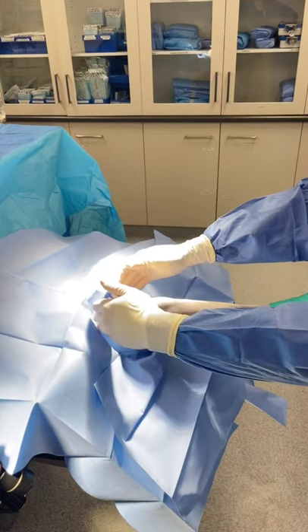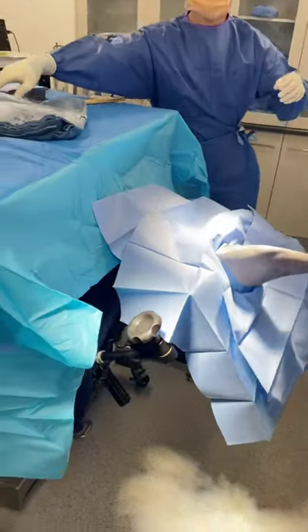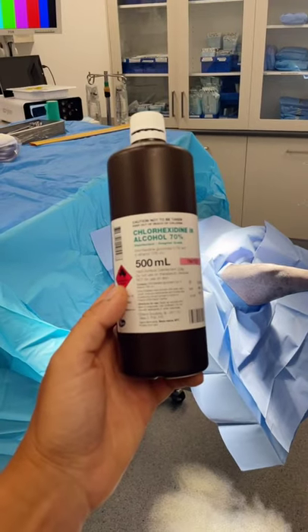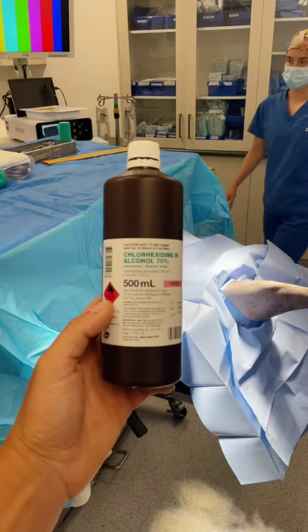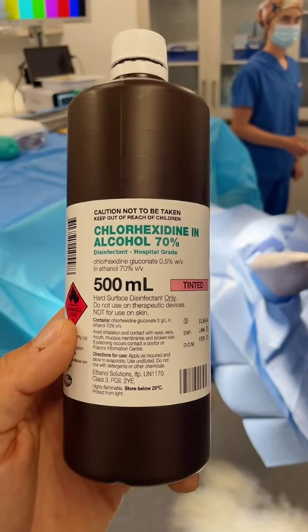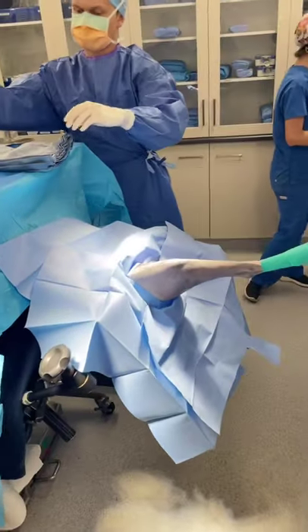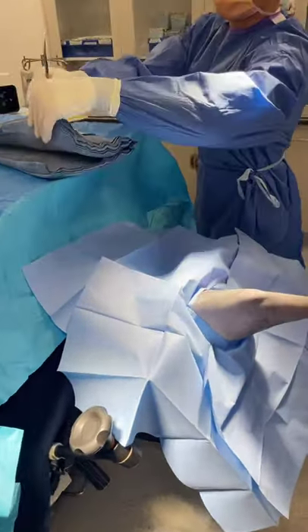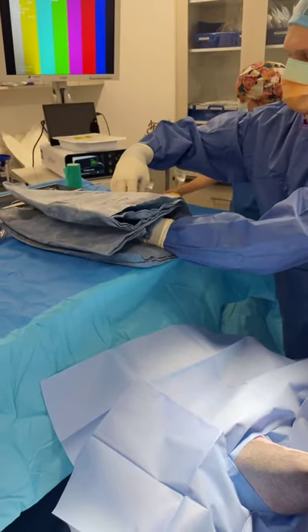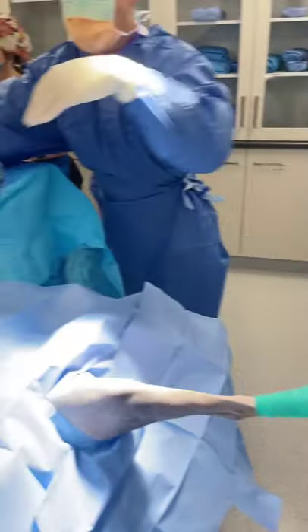When we prepare these dogs for surgery and do our aseptic skin prep, we clip them once they're induced, then do a couple of preps in the treatment or preparation area. We use chlorhexidine and then alcohol, and then a combination of chlorhexidine and alcohol together. That combination product comes prepared for us — I'll try and get that in focus for you — it's chlorhexidine at those concentrations. We use that once in the treatment area and then again once we get into the operating room. Ewan has our table drape with a hole cut in it, and we're getting organised to get that over the leg.